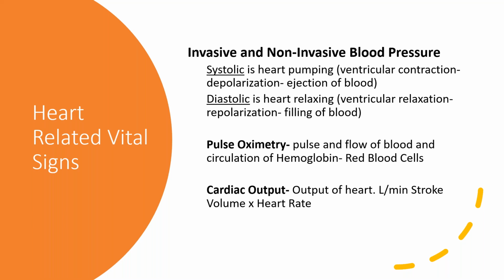So it's systolic over diastolic. And I always remember diastolic as the denominator. Someone told me diastolic for down, like the down number, D for down. So that's your invasive, non-invasive pressure. The invasive pressure is more of a static pressure with the heart pumping, because there's always pressure on the arteries. And normally it's art lines, not too many CVP lines, central venous pressure, CVP.